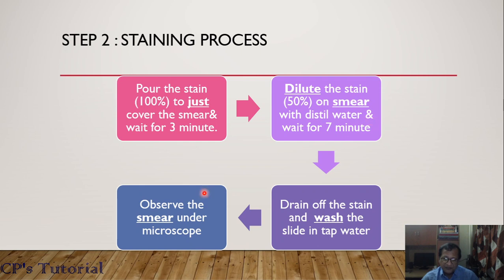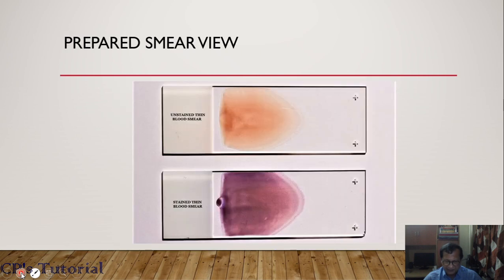And when the smear has ended, then it will be a light violet color. The visual structure of the smear will be observed in the next slide here.